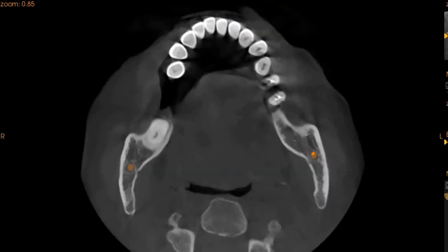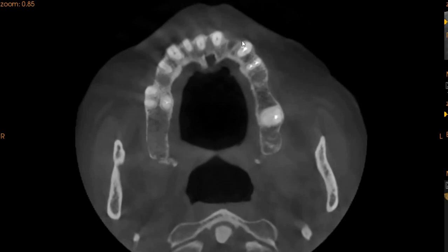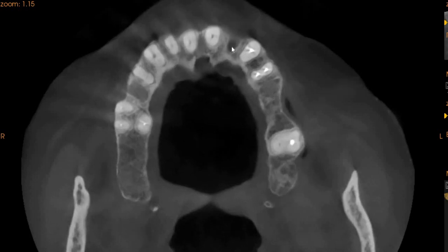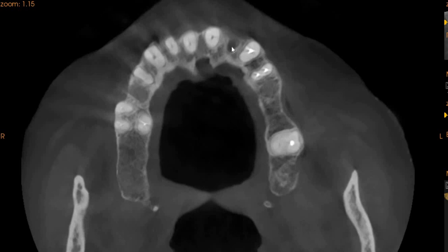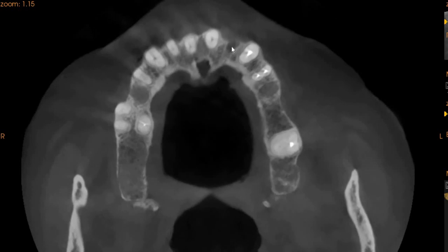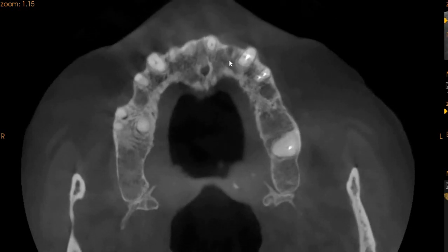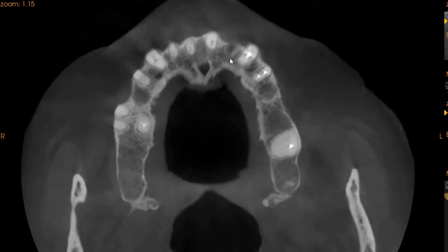On the axial view, it is visible that we have deficient bone on the buccal aspect, whereas the palatal aspect — or the lingual aspect — we can see that we have sufficient bone. This is where the extraction socket starts. We have good thick bone in the apical region where implant engagement can be done.